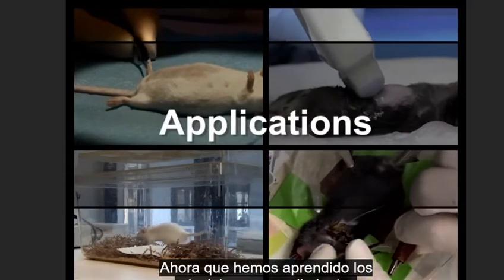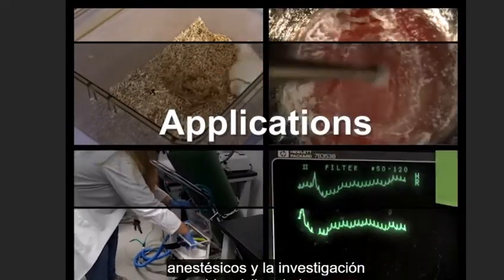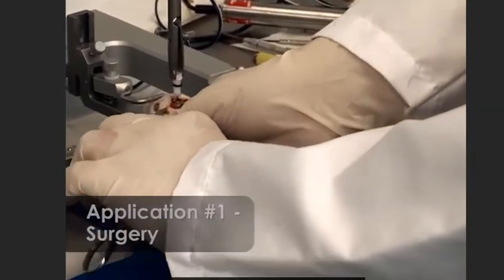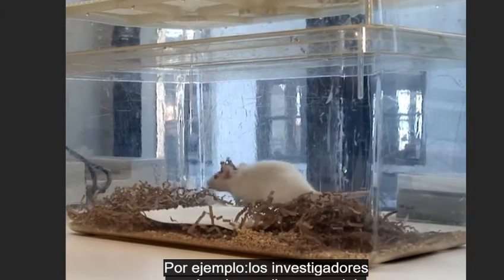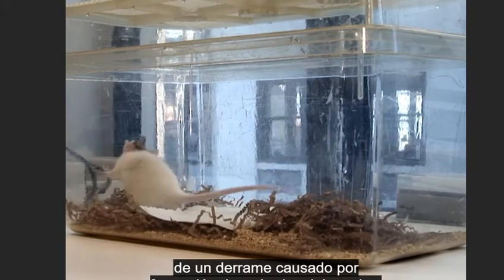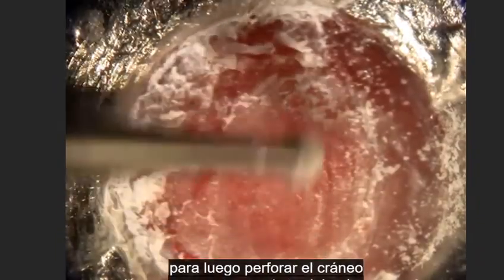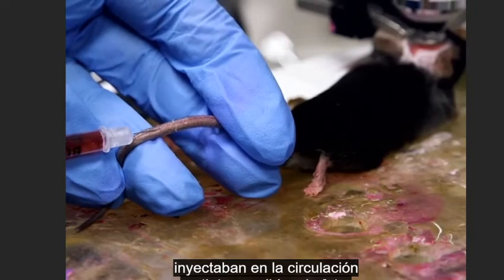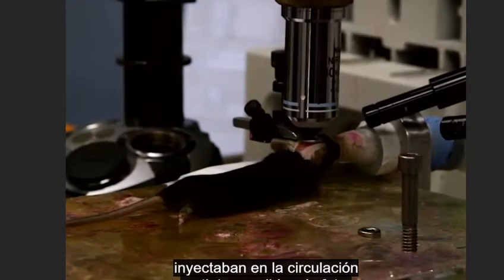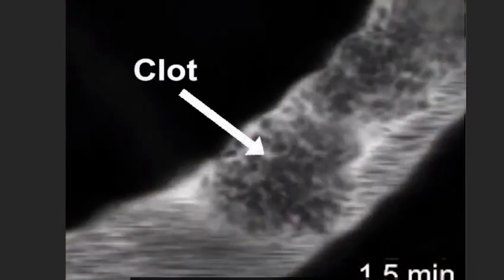Now that we've learned the principles and procedures of rodent anesthesia induction and maintenance, let's look at some frequent applications of anesthetics in biomedical research. Probably the most common use for rodent anesthesia is prior to and during surgery. For example, researchers wanted to develop a model of stroke caused by clot formation in the brain: they induced anesthesia in mice, drilled the cranium to create a thin window, injected a photosensitive dye into the circulation, and then induced photoactivation with a laser through the drilled cranium to cause formation of a clot in the cranial vasculature.